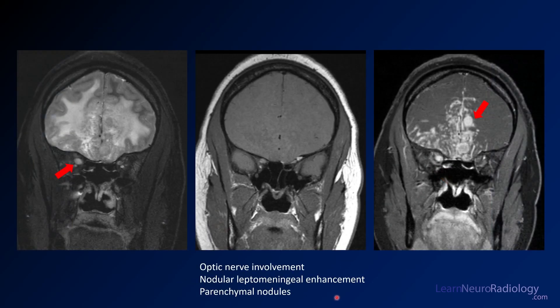Our case is a dramatic manifestation with a lot of leptomeningeal enhancement centered in the anterior cranial fossa, involving the optic nerves — avid enhancement of the right optic nerve explaining the vision loss — plus extensive parenchymal enhancement. This illustrates all features of sarcoidosis in a dramatic presentation.